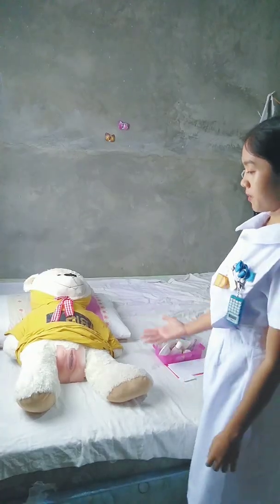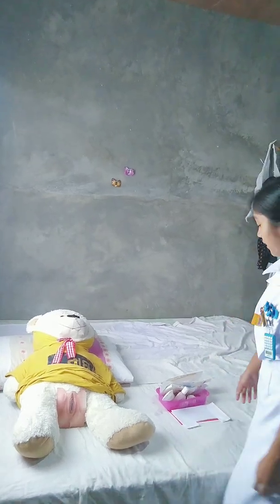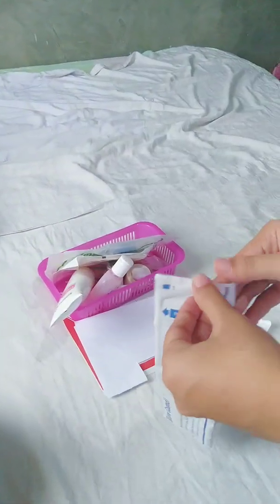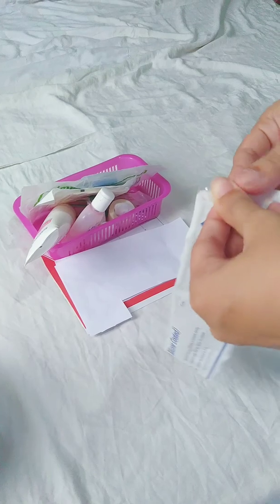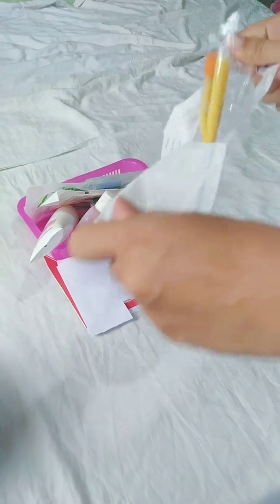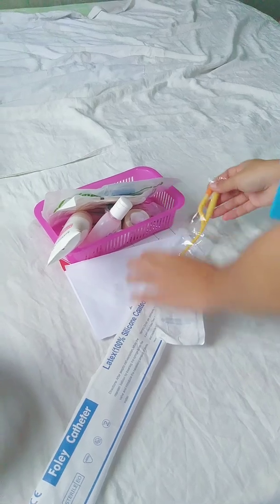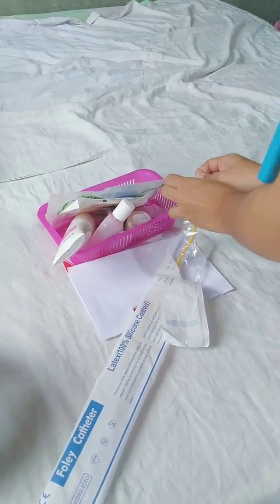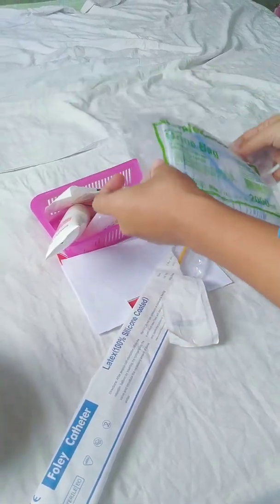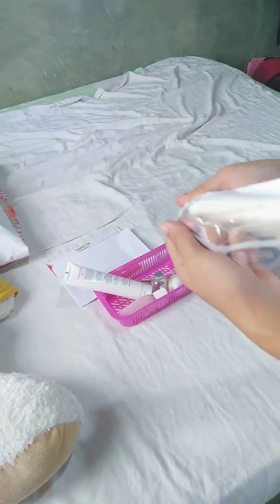This procedure is to drape the patient. Next is to open the sterile kit on the bedside table with sterile technique. Okay. Next is to apply the sterile gloves and drape the patient.